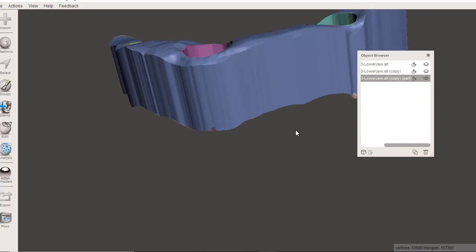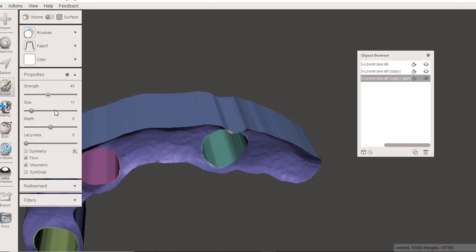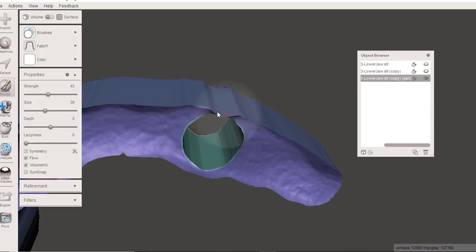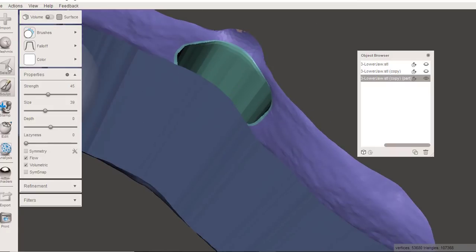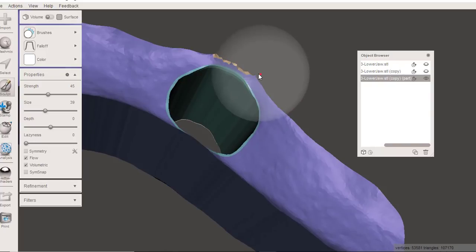Now you want to look this over, and I have one little fold right here. So what I'm going to do is take my sculpting tool, the brush, low strength, smaller brush size, and I'm going to get rid of that little fold that you're seeing right here. And if it's being ornery and you can't get it, just select that little piece, circle it, and then erase and fill. Now you can accept that, and then you could smooth that out.